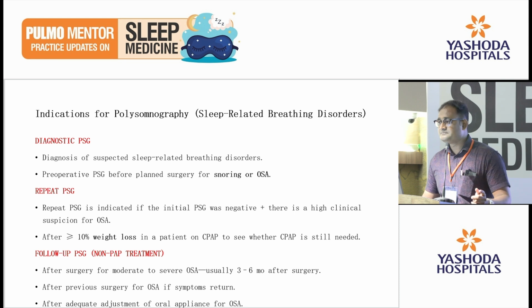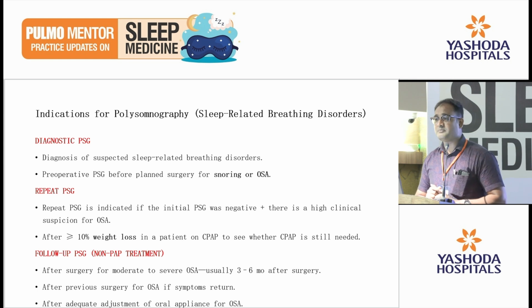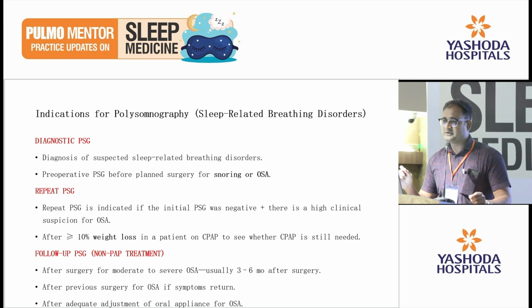Diagnostic for diagnosis of sleep-related breathing disorders, and preoperative PSG before planned surgery for snoring or OSA. Whenever you are going for an intervention, be it a surgery or oral appliance, you have to document by doing a sleep study that your patient is having OSA or not.